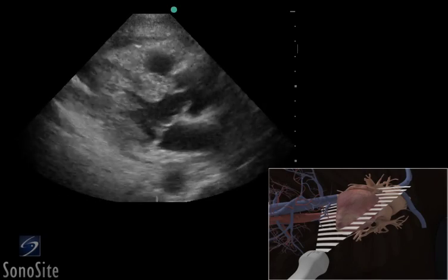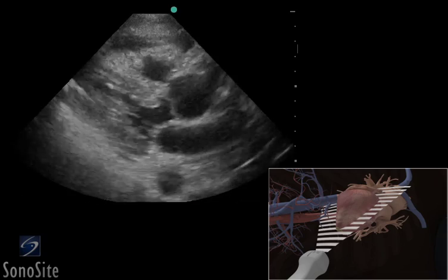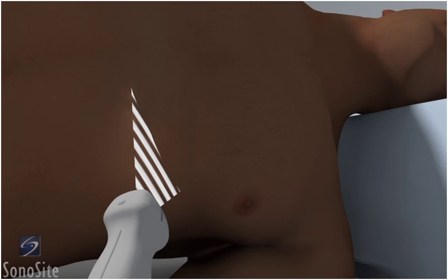A phased array transducer with a cardiac exam type is used to perform an ultrasound-guided transthoracic pericardiocentesis. The patient is placed in a left lateral decubitus position if possible.